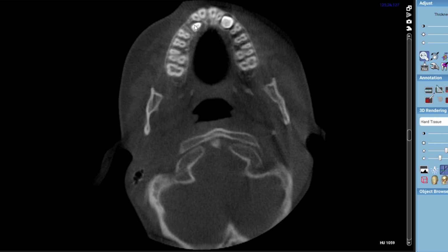One thing we can notice from this is that where these impacted eye teeth are erupting is very close to the roots of the permanent teeth that are already there. So we can decide how urgently we need to act to preserve the health of the teeth.